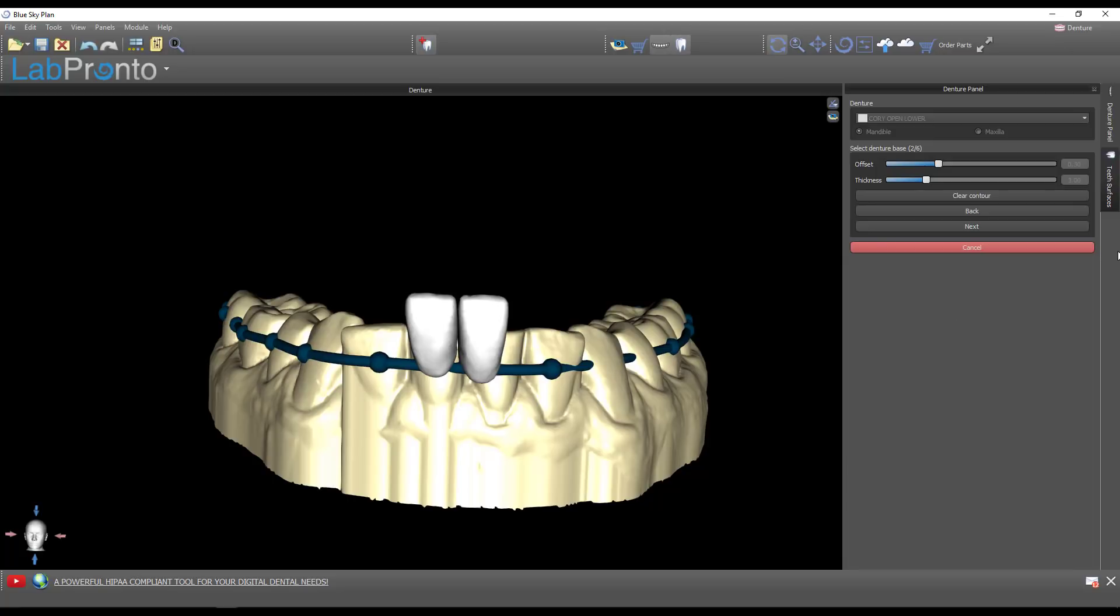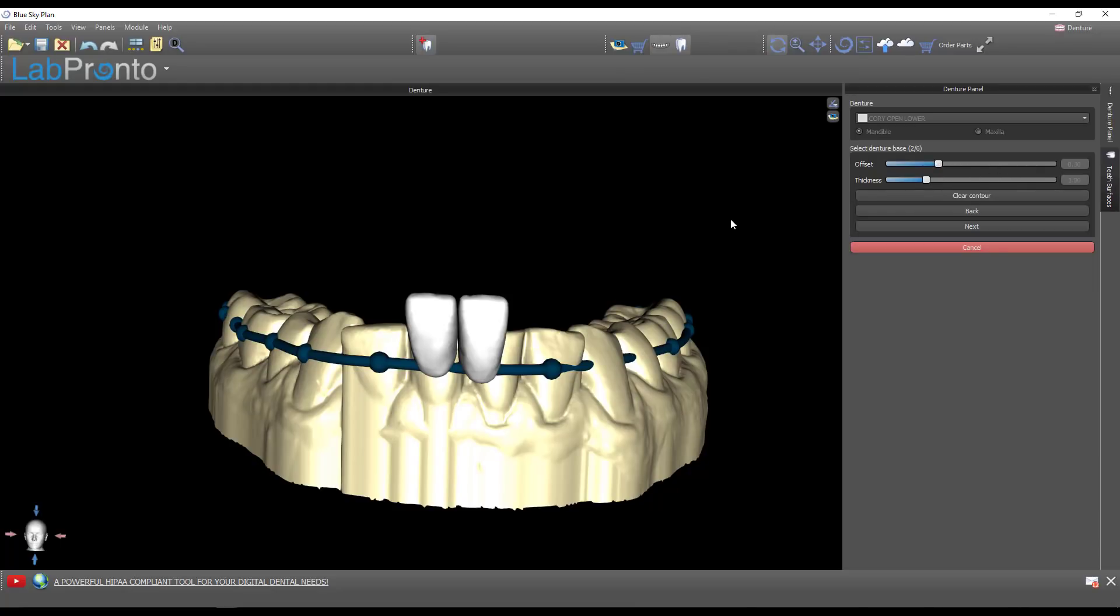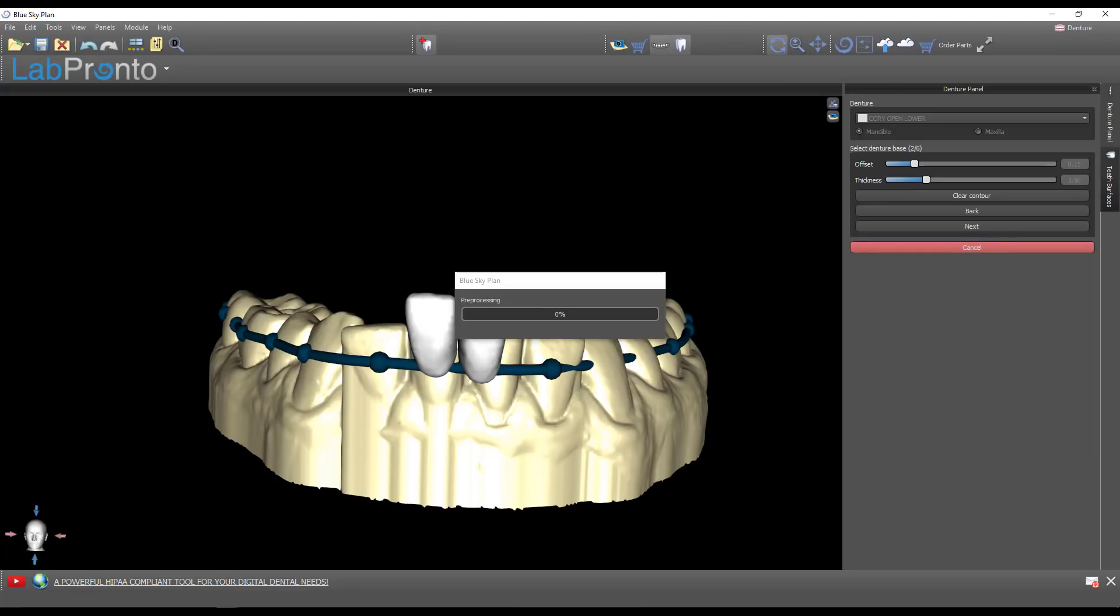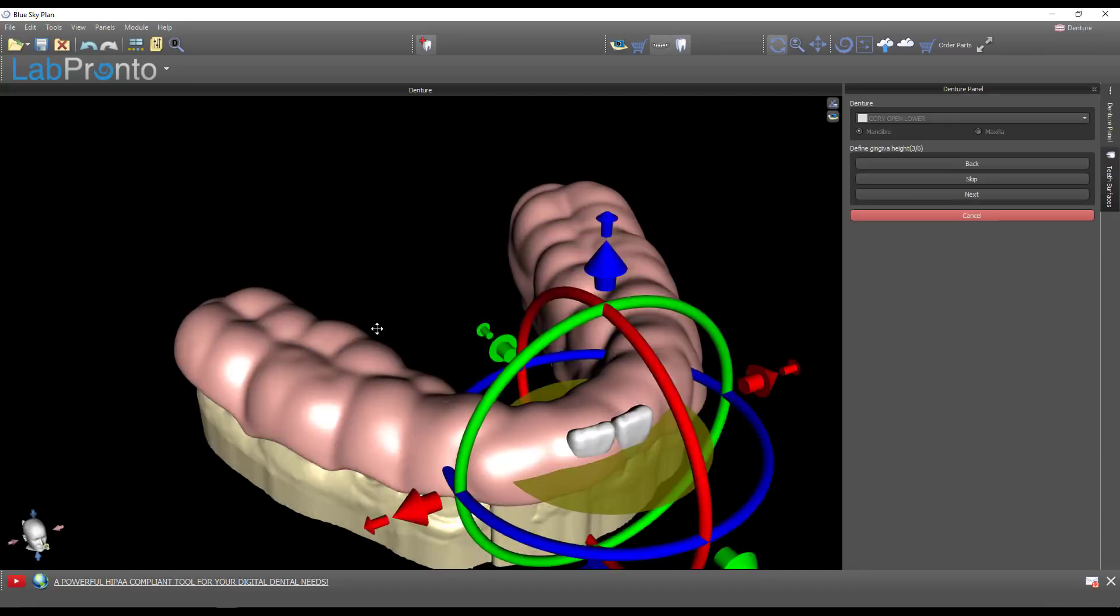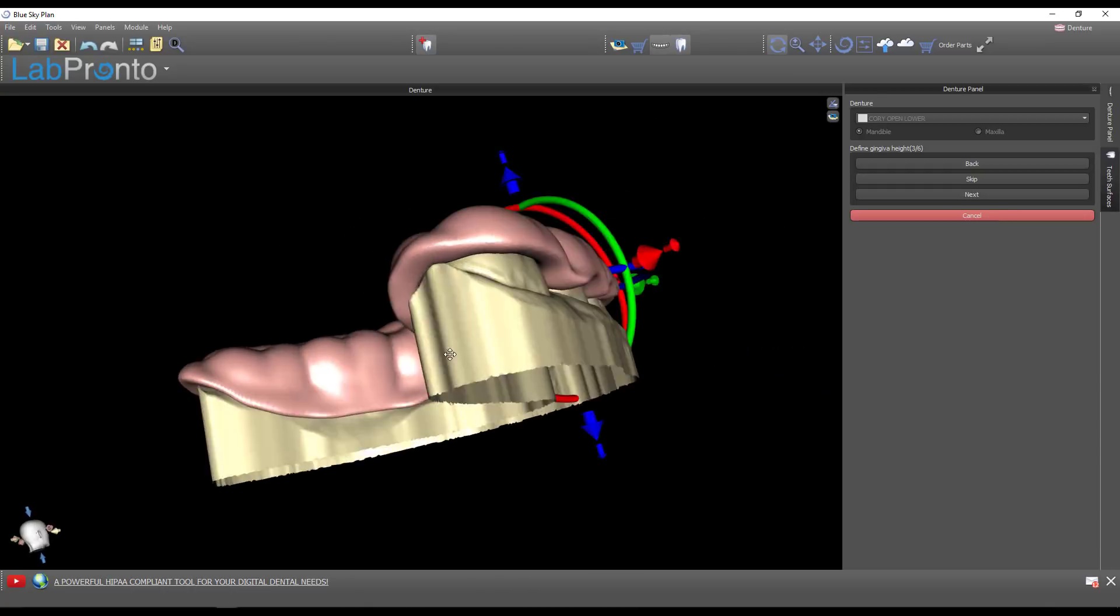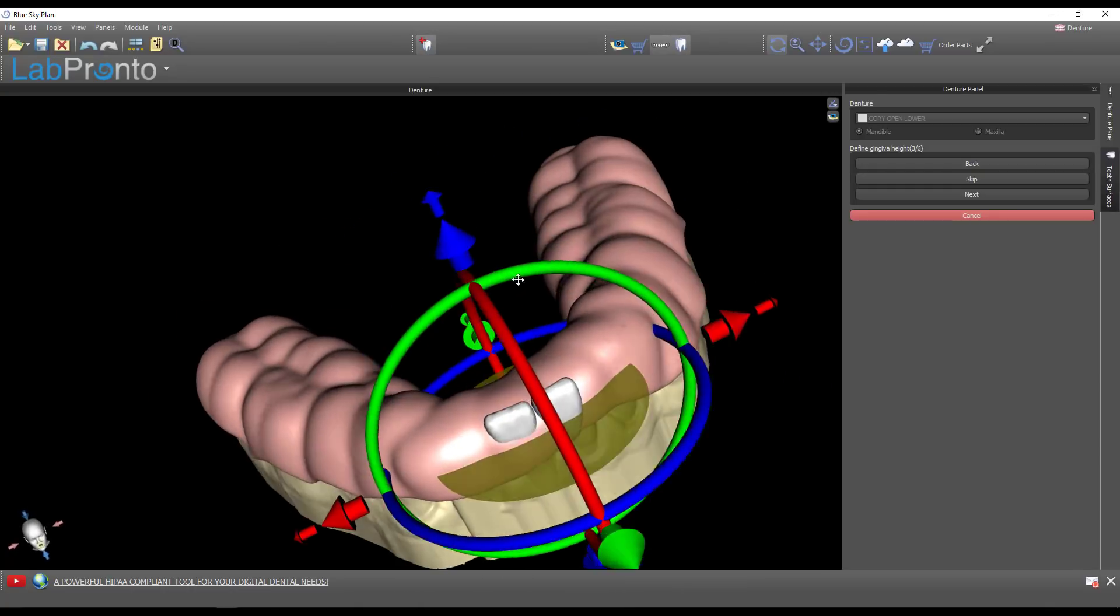This is a very important step. What is the thickness of this guard? Three millimeters is probably appropriate for most people. How much offset do you want to create? The offset is the amount of slop space between the teeth and the underside of the night guard. If you zero that out, I would not expect that to fit very well. I'm going to drop this down to about 0.15.